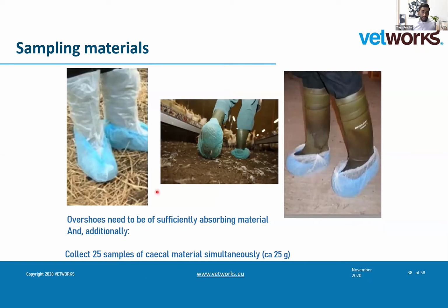Again, the overshoes need to be absorbent enough to be effective, so that we do an effective sample. Basically, what you do is you arrive at the house, you put on these boot swabs, and you walk through the house back and forth, and that should be enough.